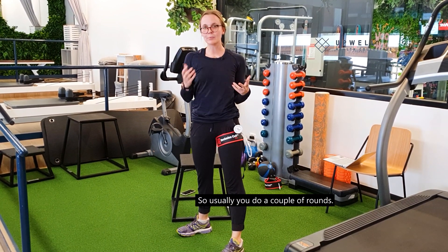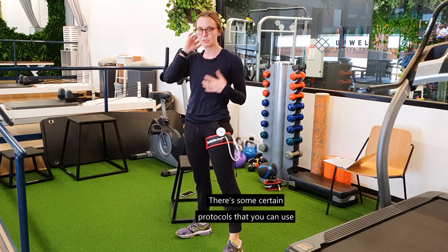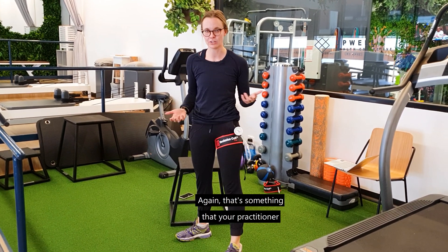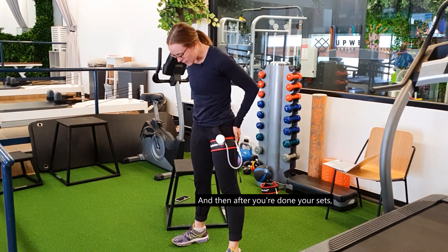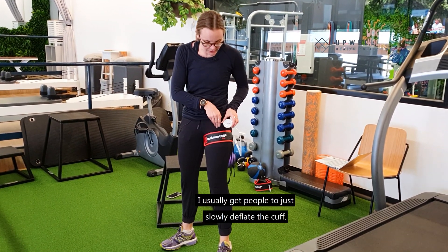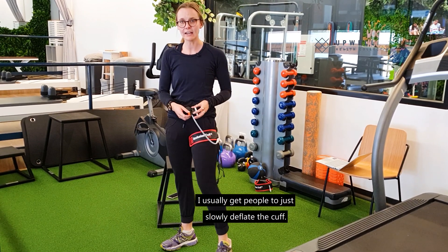Usually you do a couple of rounds. There are certain protocols you can use to get different results — again, that's something your practitioner can help you with. After you've done your sets, I usually get people to slowly deflate the cuff.